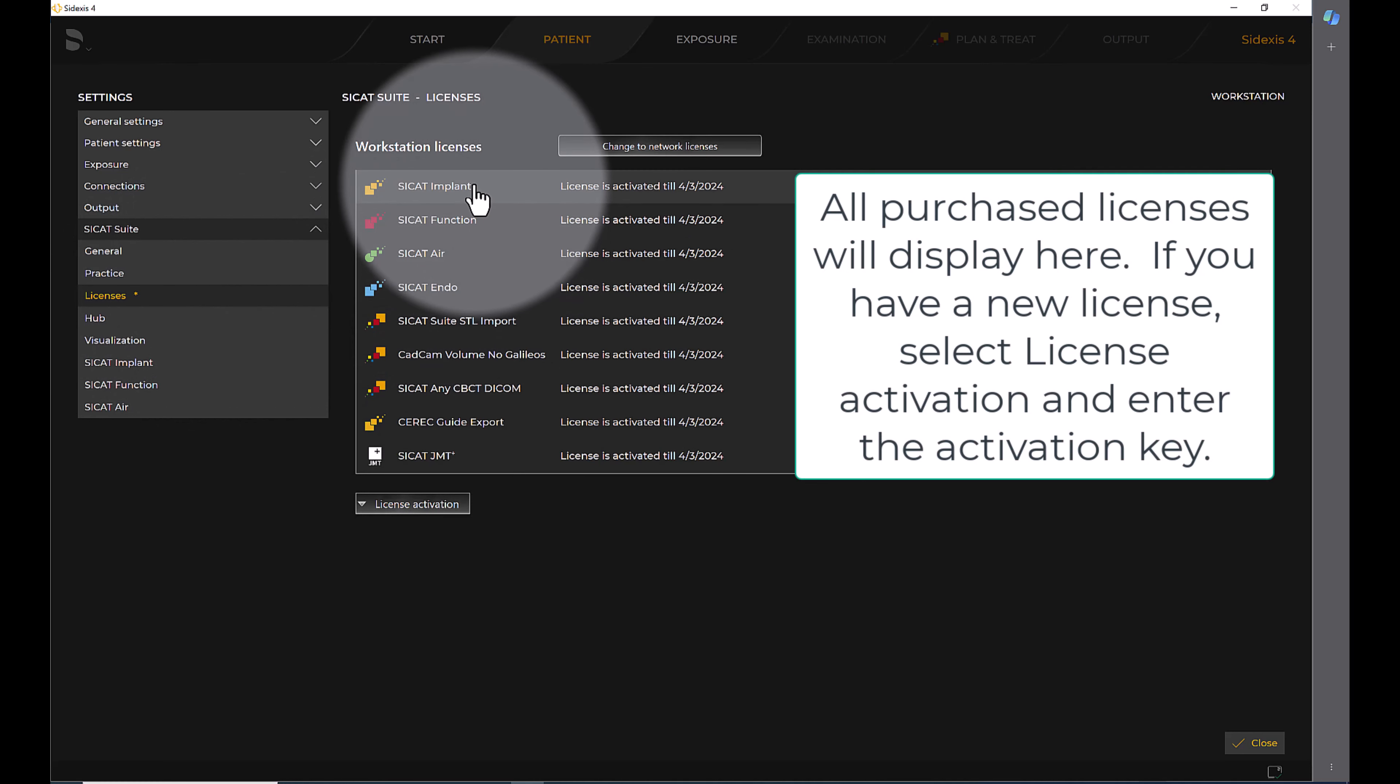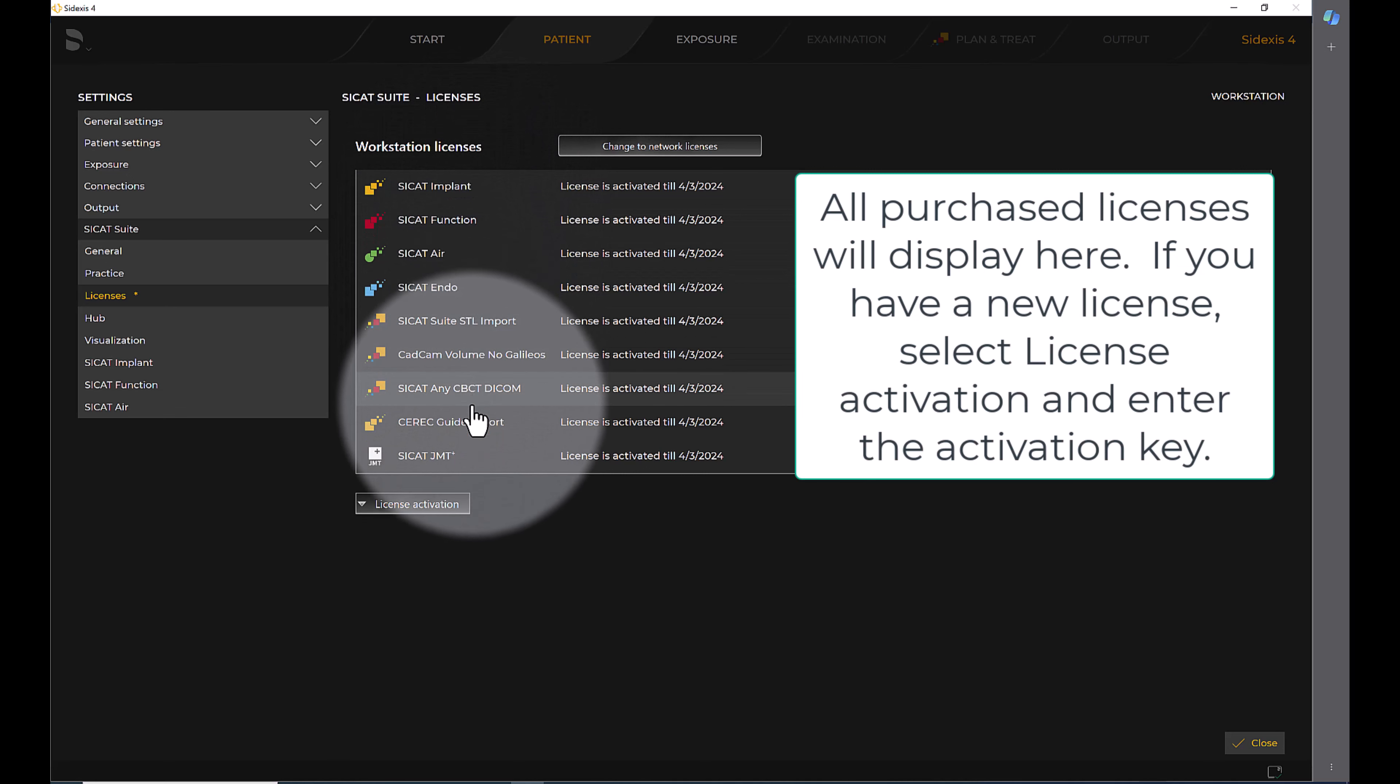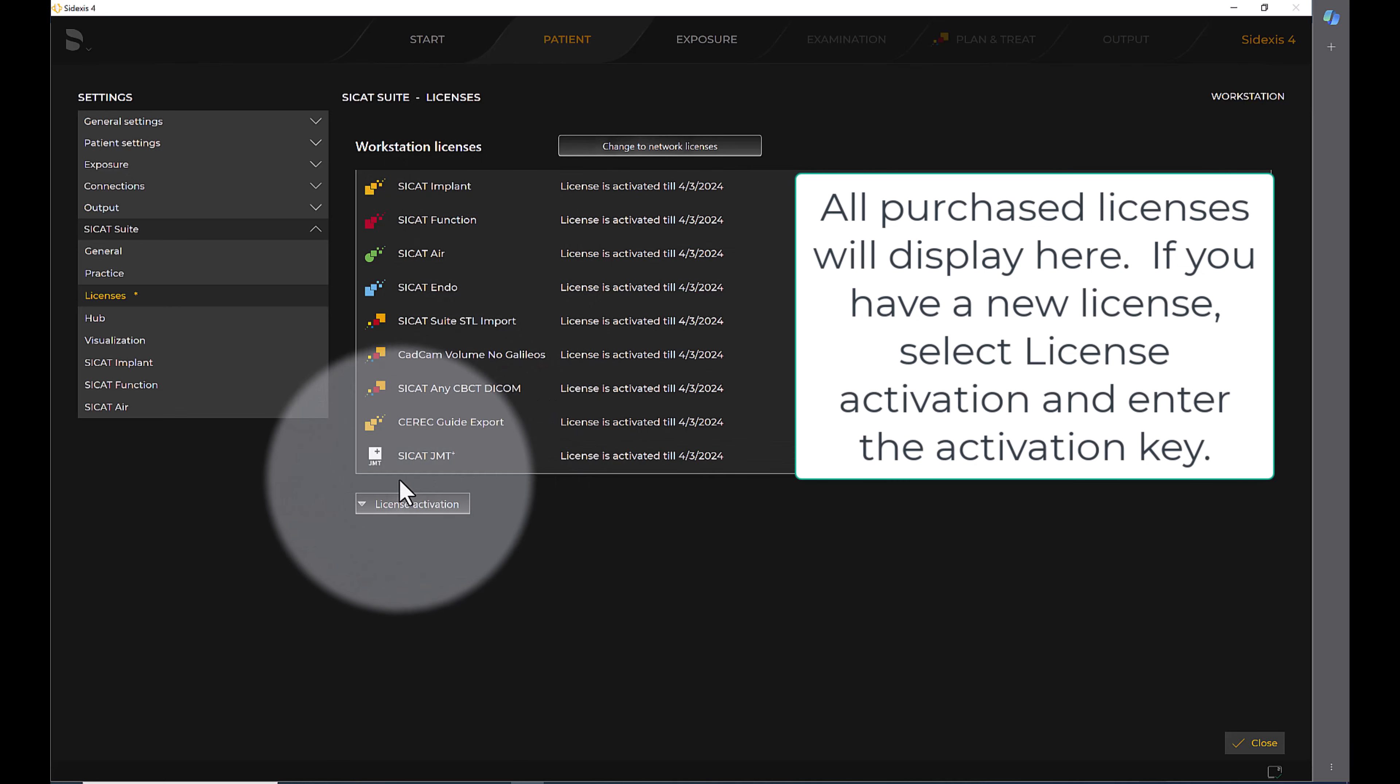All purchased licenses will display here. If you have a new license, select License Activation and enter the activation key.